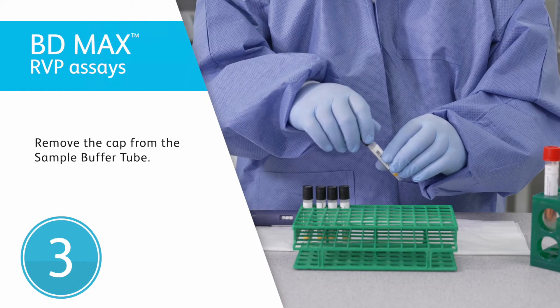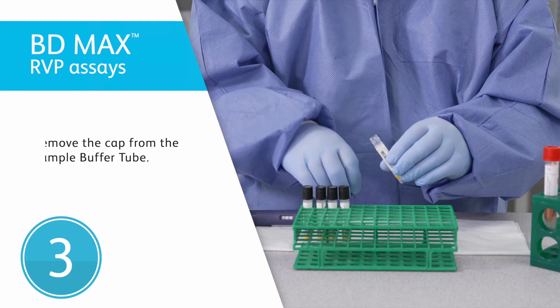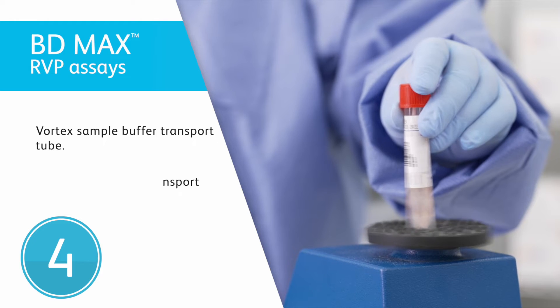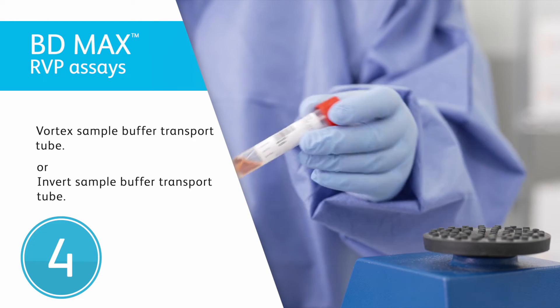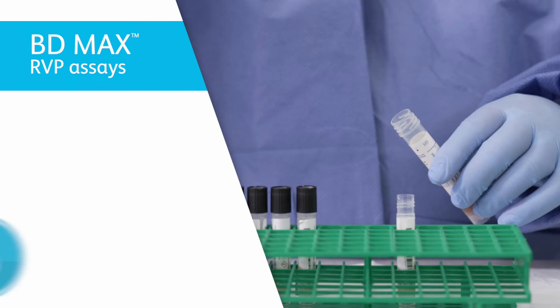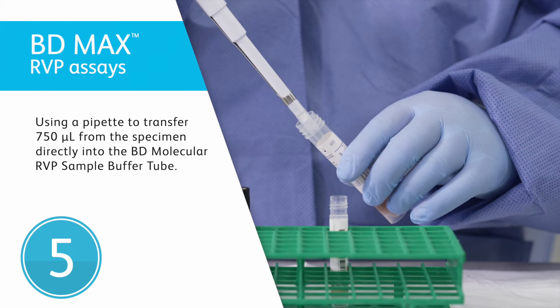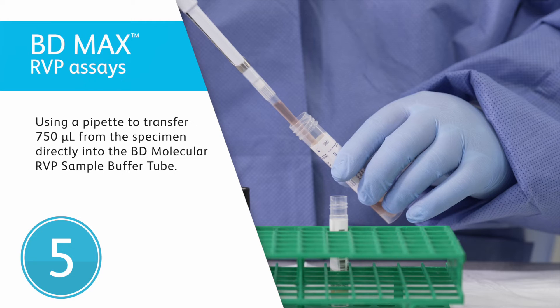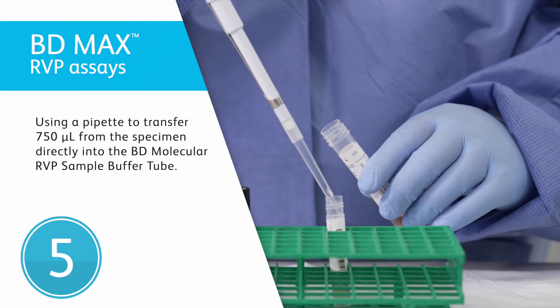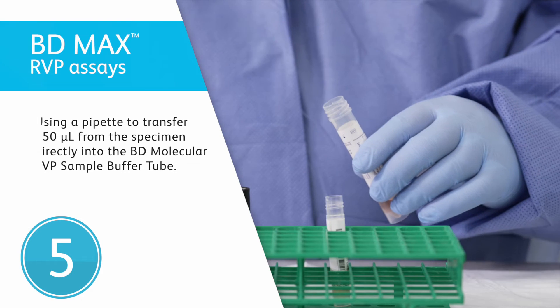Remove the pierceable cap from the sample buffer tube. Briefly vortex 5 to 10 seconds, or invert the sample transport tube 8 to 10 times. Using a calibrated variable pipette, transfer 750 microliters from the specimen directly into the corresponding BD molecular RVP sample buffer tube.